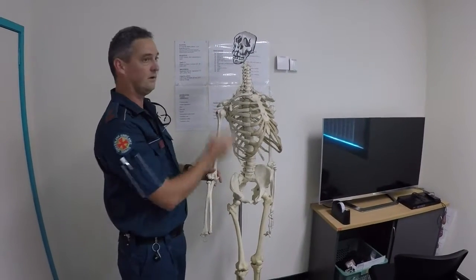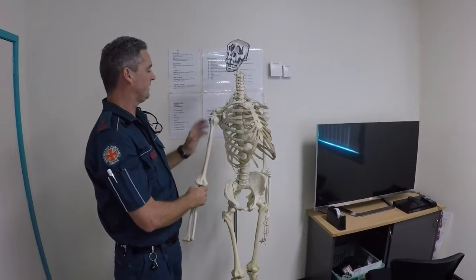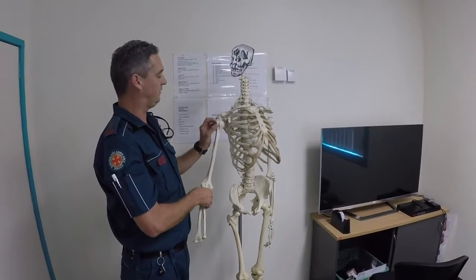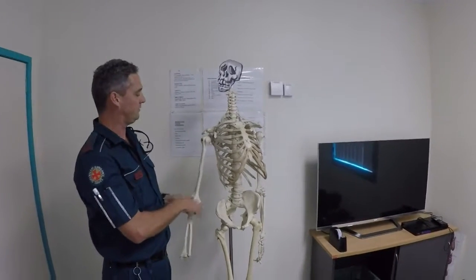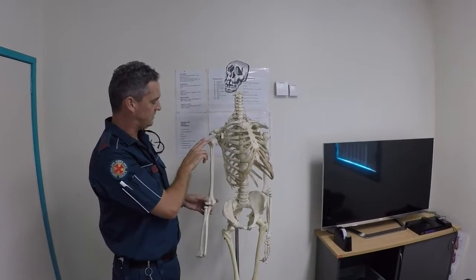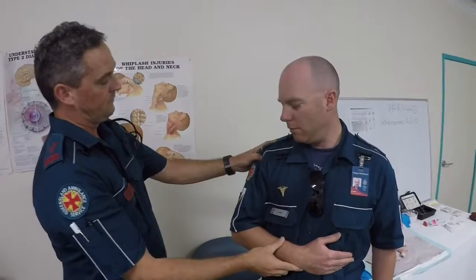It has a higher flow rate than the other 2 insertion sites, and from reading the Easy IO website, potentially is less painful than the tibial insertion, and as a result that becomes our preferred insertion site with the QAS CPG and the Easy IO website.